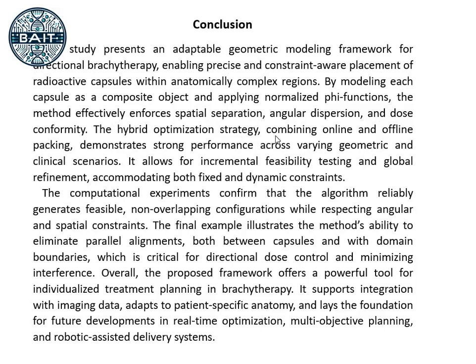The hybrid optimization strategy, combining online and offline packing, demonstrates strong performance across varying geometric and clinical scenarios. It allows for incremental feasibility testing and global refinement, accommodating both fixed and dynamic constraints.